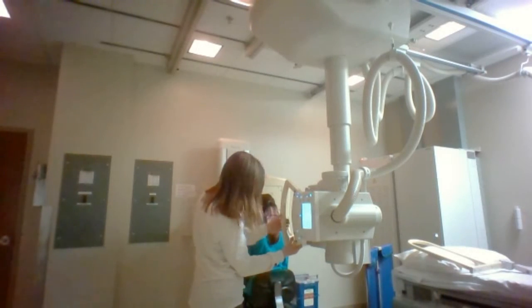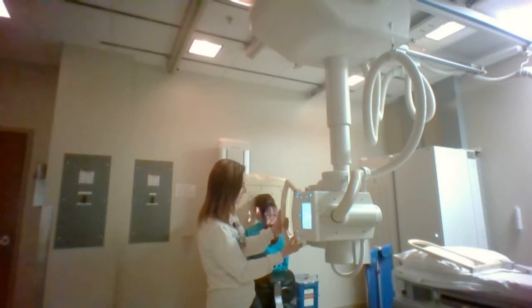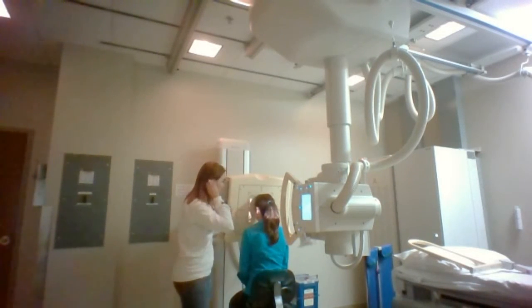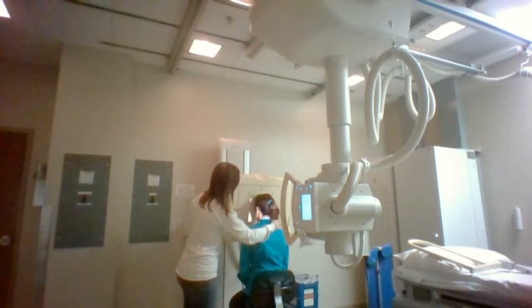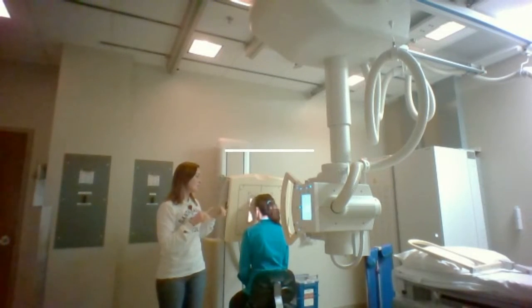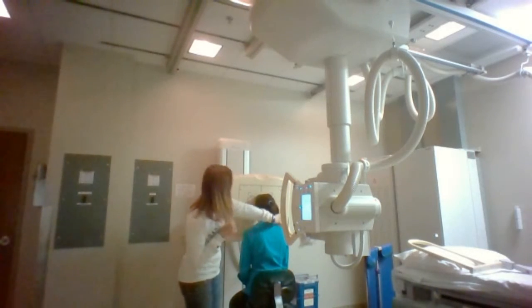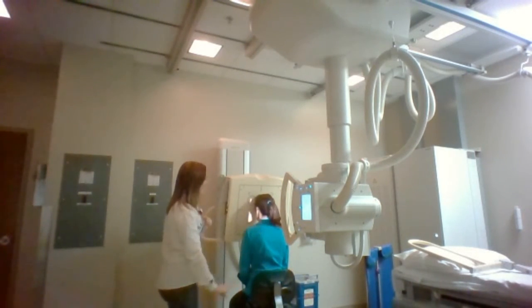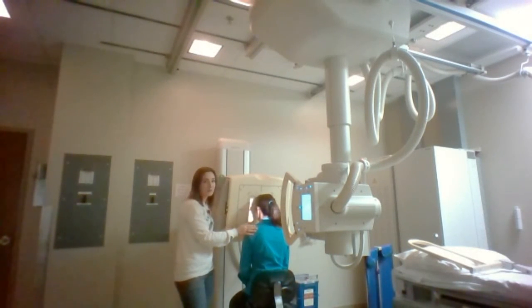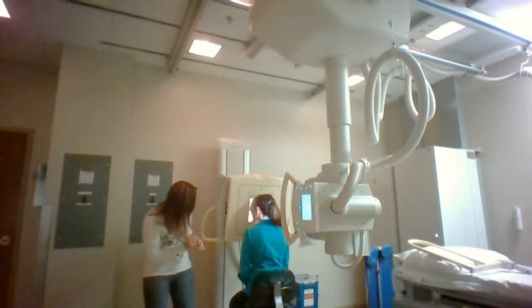And then I'm going to have my there we go. I didn't mention this before, but it's also important to make sure that your patient doesn't have any sort of jewelry on, earrings or hairpins. Sky just has this little hair tie here, and there's no metal on it, so she is set and ready to go. And I'm just going to put her a little bit more this way. Her forehead and nose is touching the board. And my beam is exiting the nasion.